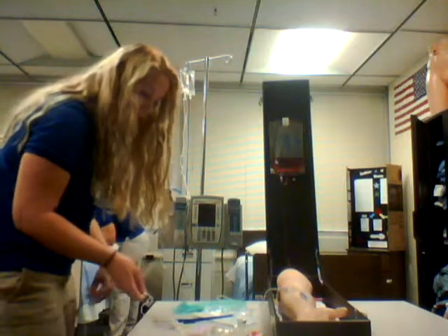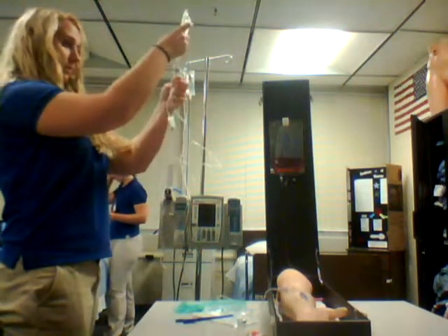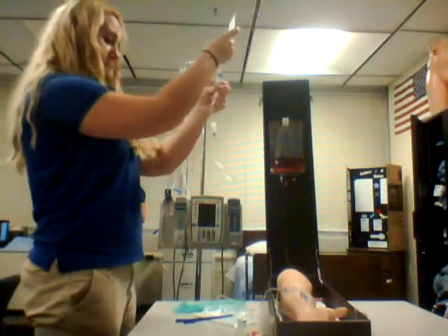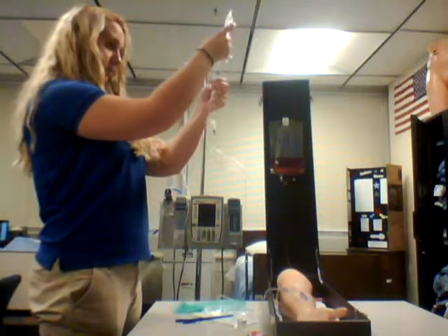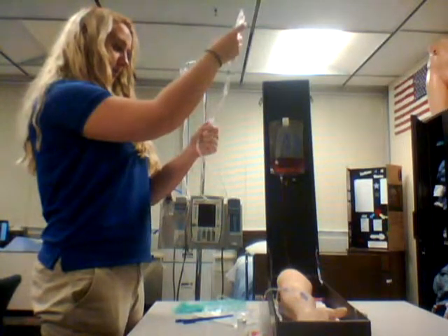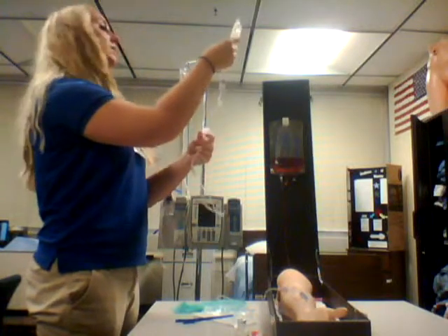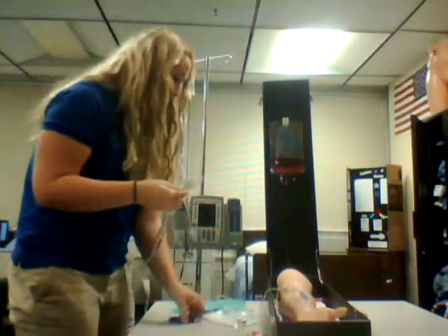And I'm going to inspect the IV site. I don't see any rash. I don't see any redness or swelling. I'm going to prime the tubing and ensure that there is no air. There's no air. And now I'm ready to go into my patient's room.